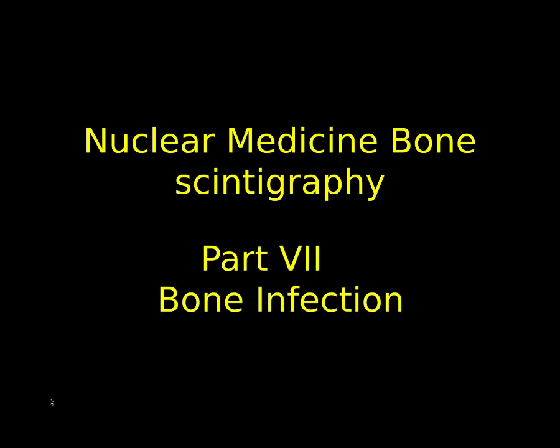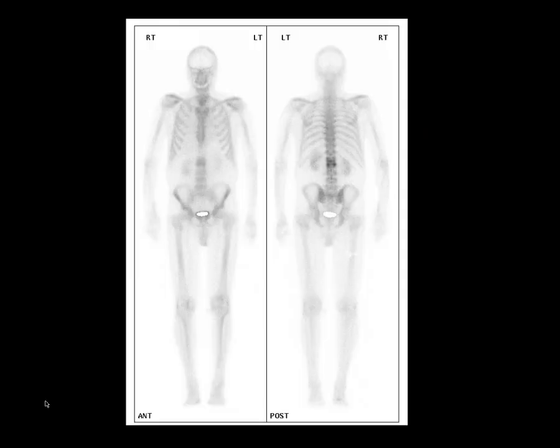Hello, welcome to Nuclear Medicine Bone Scintigraphy, Part 7, and today's talk is on bone infection. So, this can be quite a tricky and confusing topic.